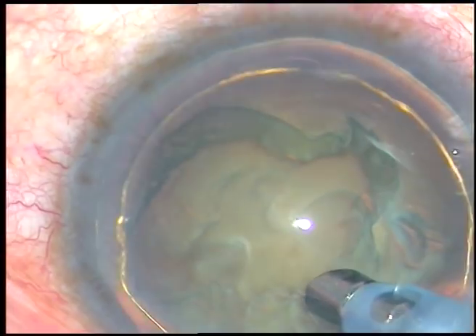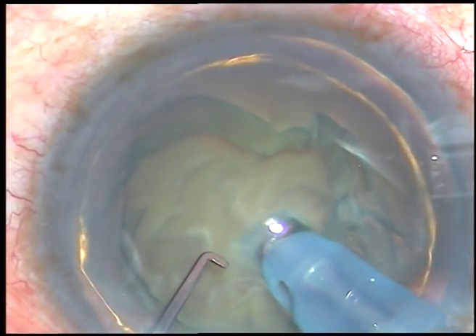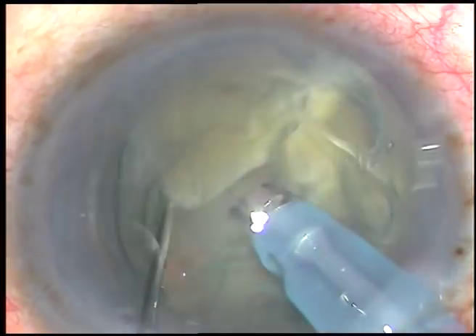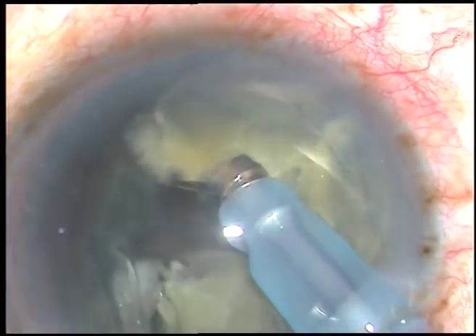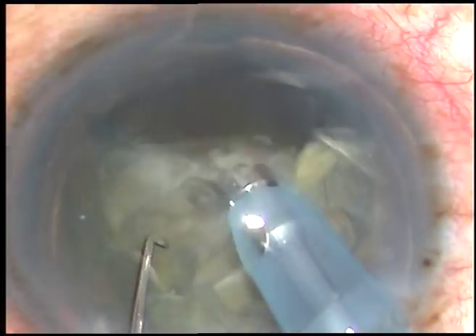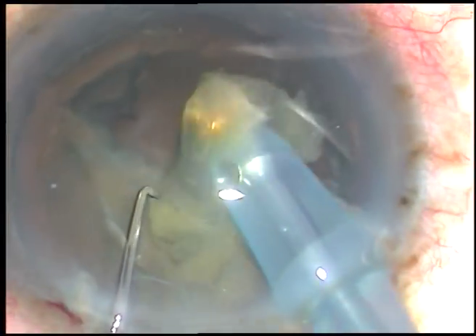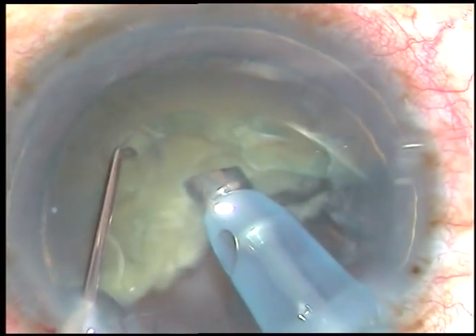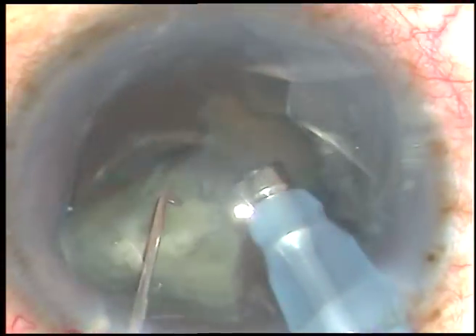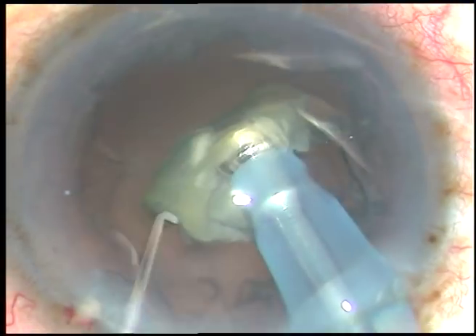I clean the superficial cortical matter, bury the tip into the substance of the nucleus, have a firm purchase on the nucleus, and chop it. Now I rotate the nucleus and chop it at another place. The free nuclear fragment is emulsified with ultrasonic energy and removed. Ultrasonic energy used in this case is 60%, flow rate is 45 ml per minute, and vacuum is 450 mmHg. This is the last nuclear fragment, being emulsified very comfortably.